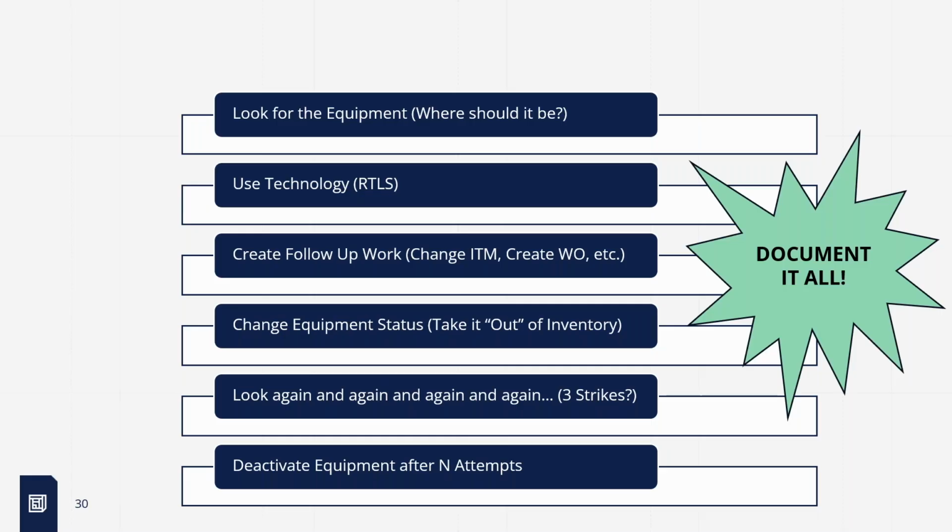Where before it was like, hey, you got promoted to clinical engineering manager. Do you have the credentials to be a clinical engineering manager or not? If you don't, that's a huge ding on your department. So that's something they're looking at more and more. Do you have a qualified individual running the department, but also is everyone qualified to work on that equipment as well? Are you tracking your certifications in your CMMS, and does that appear on your compliance documentation?